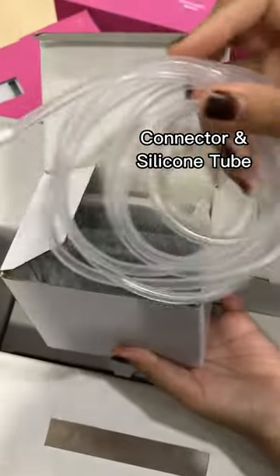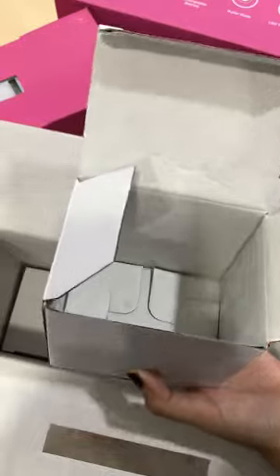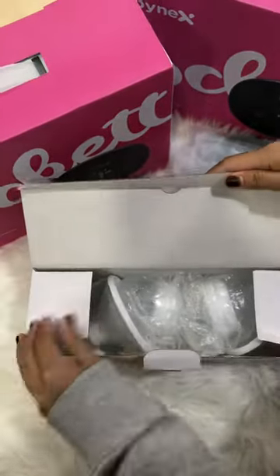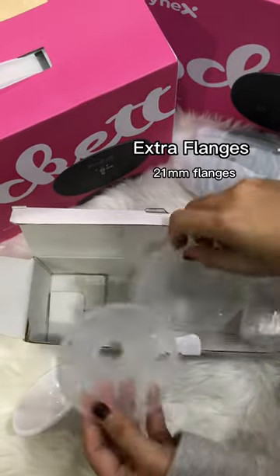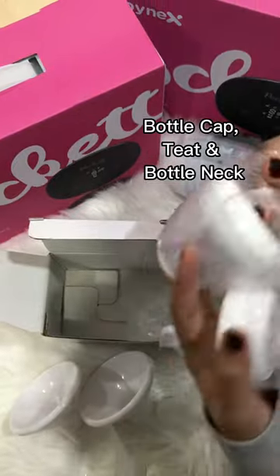Also included are the connector and silicone tube, the pump motor, a Type-C cable, flanges with a dust cover, extra flanges, a bottle cap, a teat, and the bottle neck.